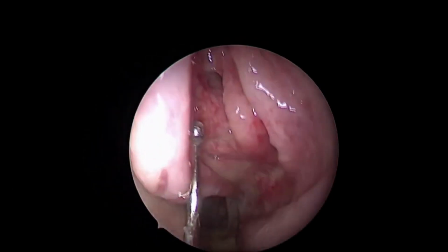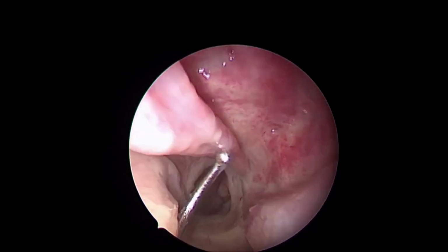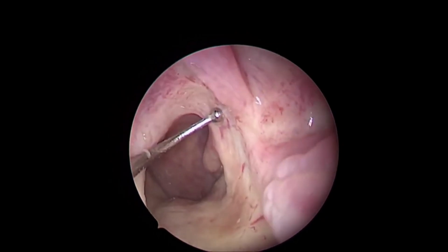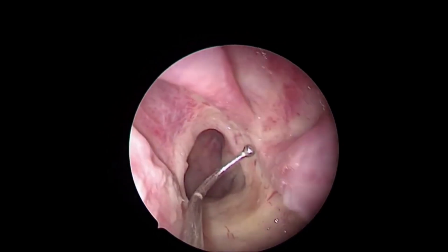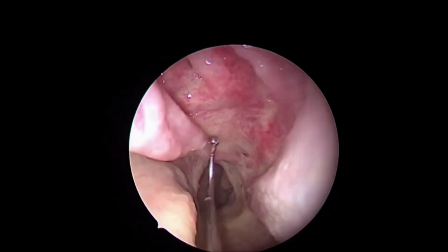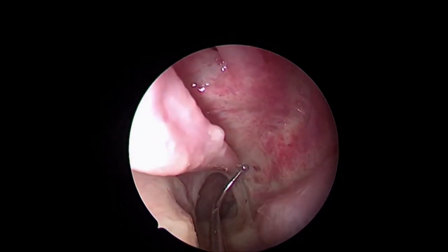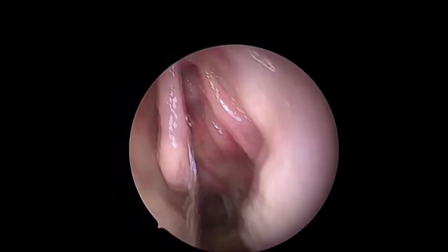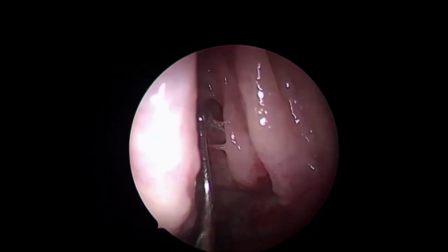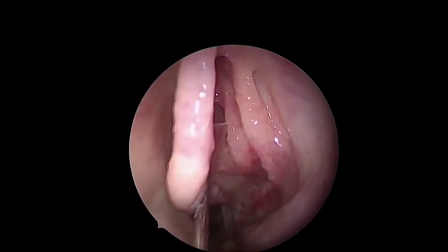And the third part, continuing behind the sagittal part of the turbinate in the axial plane, goes almost to the roof of the nasopharynx, or sometimes to the medial pterygoid plate, or the perpendicular plate of the palatine bone. This goes like this in the axial plane, known as the third part of the turbinate. So all these parts together in different planes contribute to the stability of the turbinate. This is a very important structure anatomically as well as functionally.